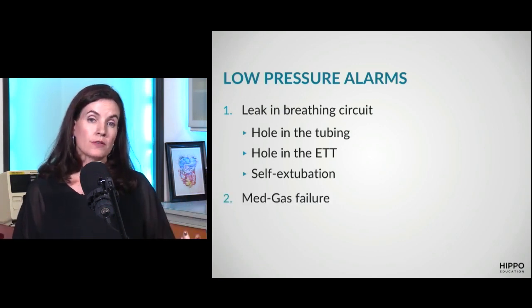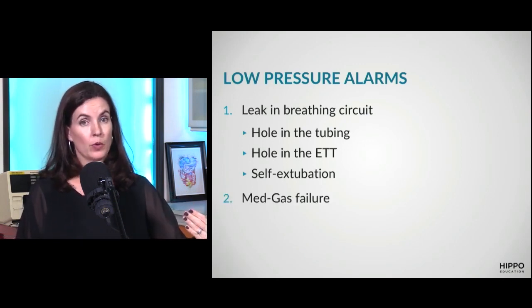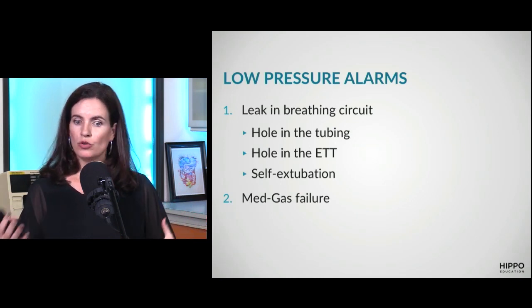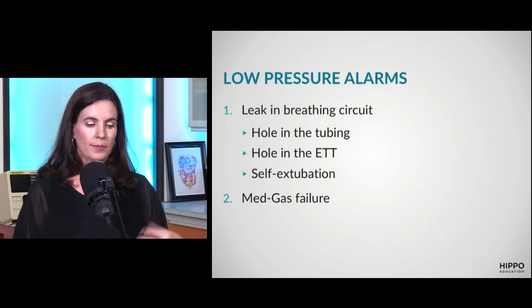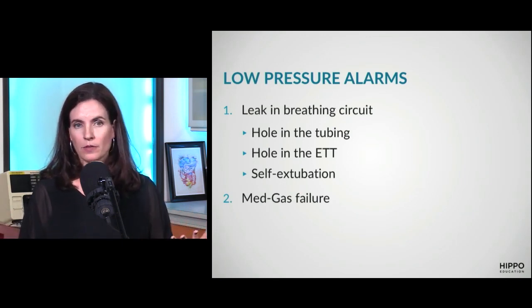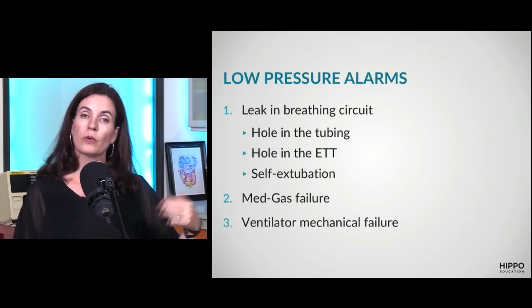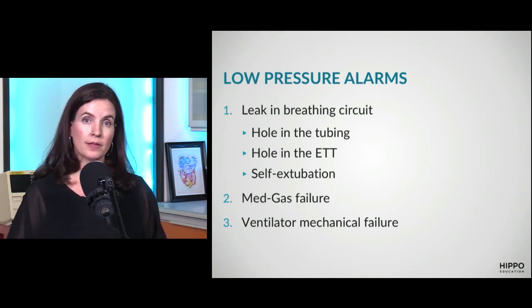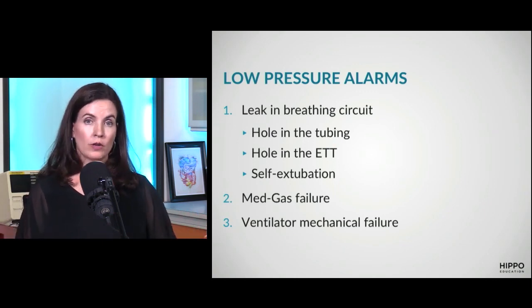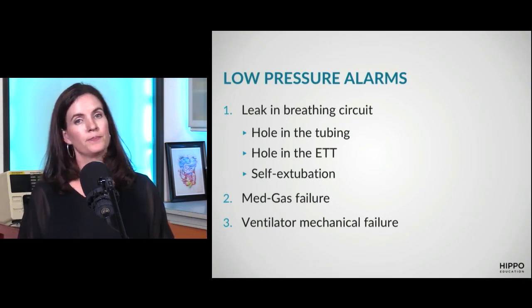Now, in rare circumstances, you can have med gas failure. What I mean by this is, in your hospital, the medical gas in the walls can stop flowing. You usually know this because it's a form of internal disaster, and often they'll call a code overhead notifying people that this has happened. So this is usually not a surprise. And you can also have a total failure of your vent, where again, you would just take the patient off and bag. But low pressure alarm is a leak until proven otherwise. So if you're seeing that flashing at the bedside, you can examine the tubing and the endotracheal tube to make sure there isn't a hole, or in fact, to find the hole and then plug it.